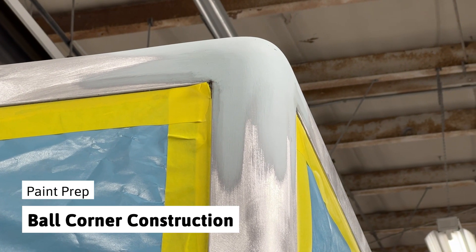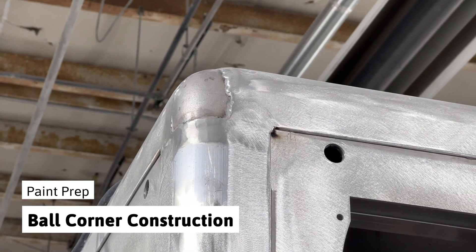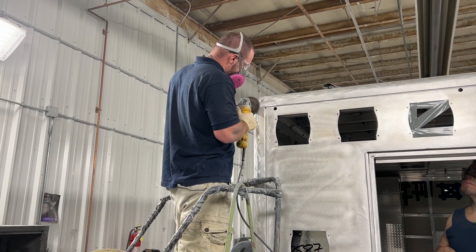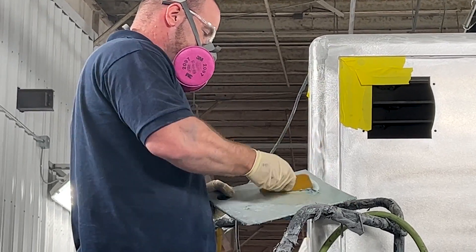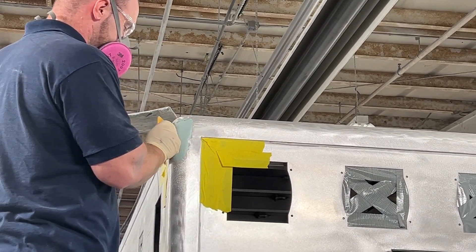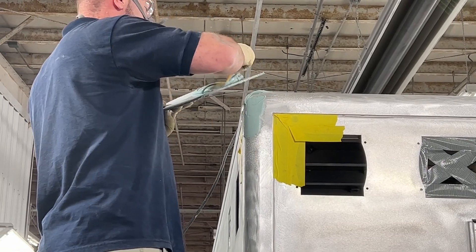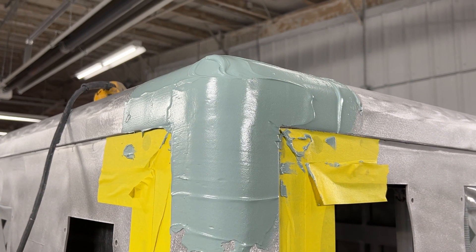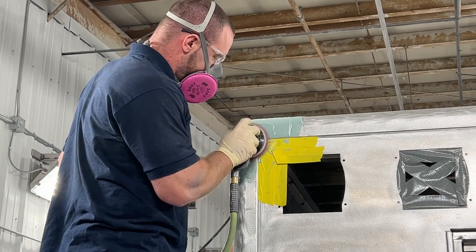One signature look on a PL Custom ambulance body is our rounded ball corners. The welded corners are ground down to smooth out any hard edges. A two-part mixture consisting of bondo and a hardening agent are applied in multiple layers. An orbital sander is used first to shape the corner.